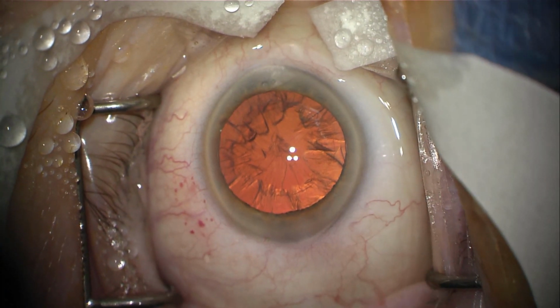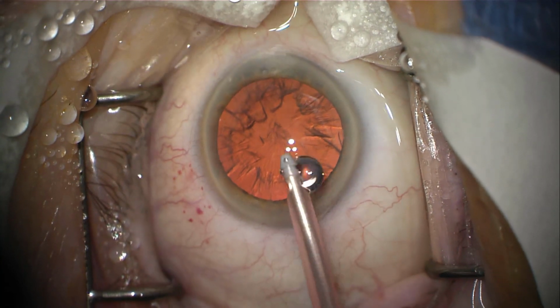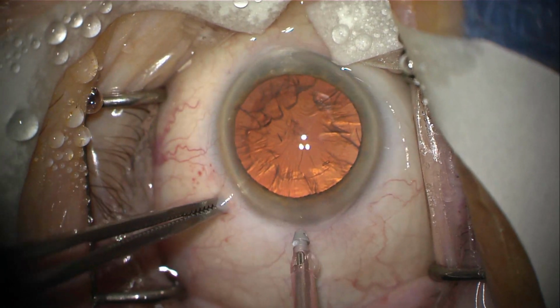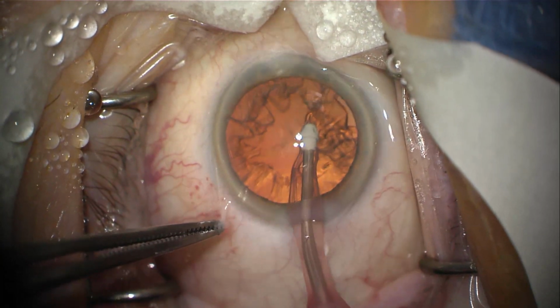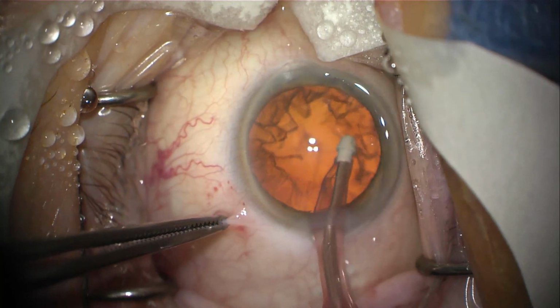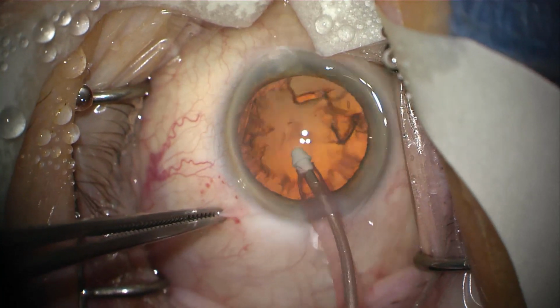I just applied some more numbing drops. The cortex is like a soft chocolate. Imagine an M&M that has a very dense, thick chocolate in the center, but very soft chocolate in the periphery of the edges. I'm inserting what's called an irrigation aspiration device, and I'm gently sucking out those very soft pieces of what's called cataract cortex that sit in the periphery.